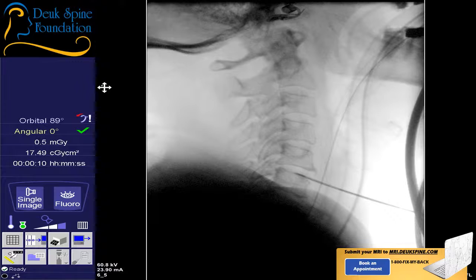So I'm just going to keep working, and you guys can watch and listen. If you have questions, type them up, and we'll do our best to answer them. We're going to start with the discogram. Our patient is not awake. She's asleep. She's intubated.